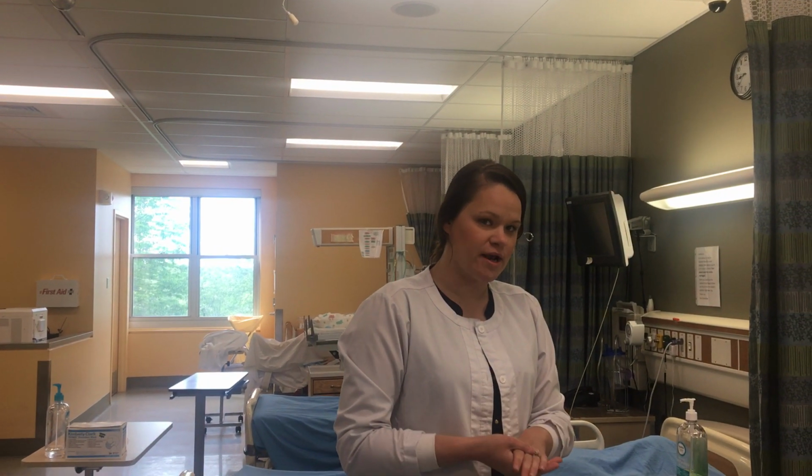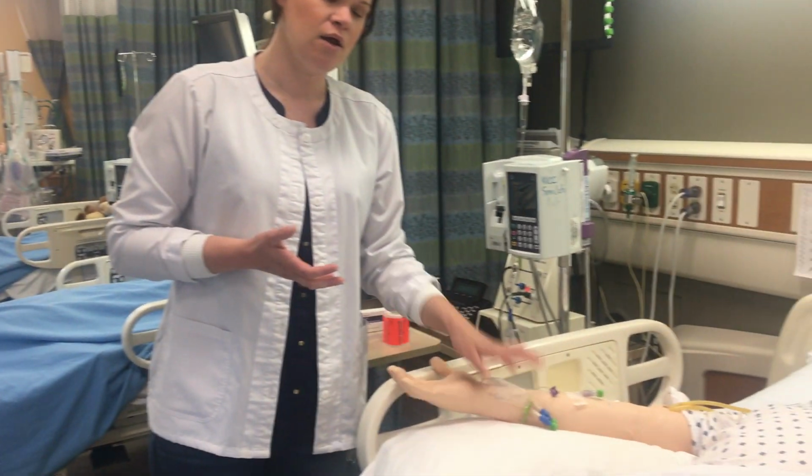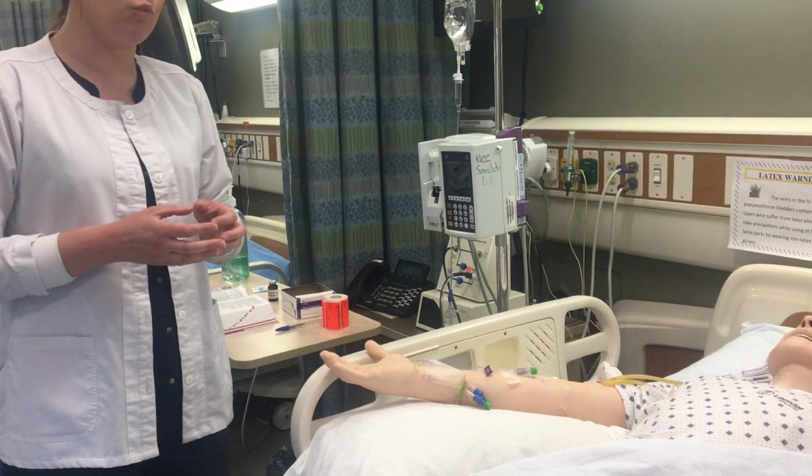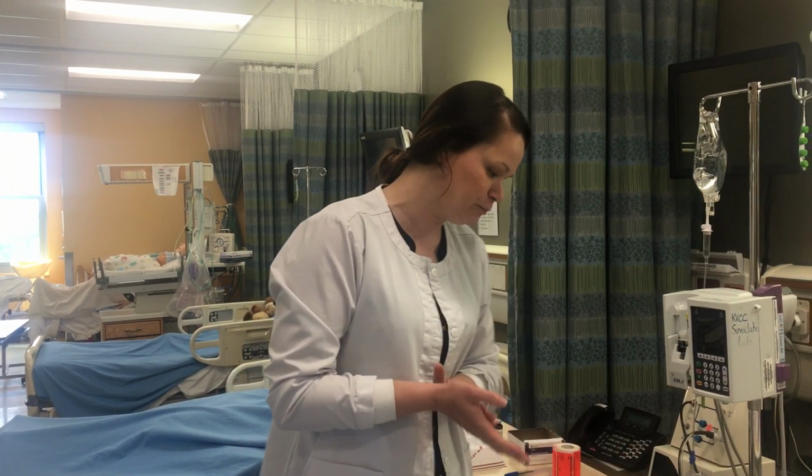So the first skill that I'm going to perform is the demonstration of an IV push or IV bolus medication through a non-running or INT intravenous line. This is a peripheral line. Later in the other video segments, we are going to discuss the administration of an IV push medication through a central venous access line, but for now we're going to focus on the peripheral.